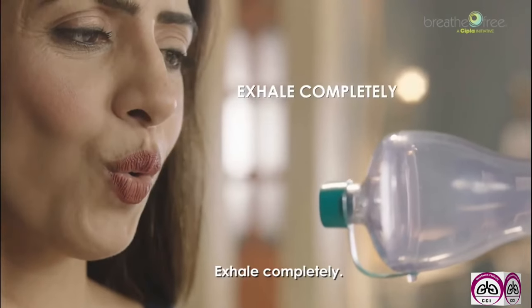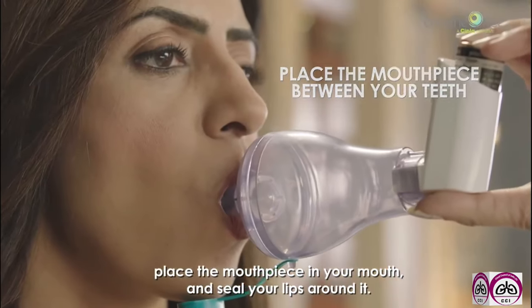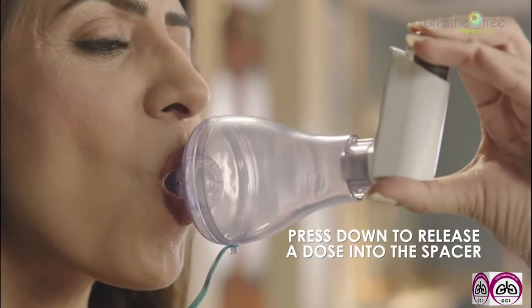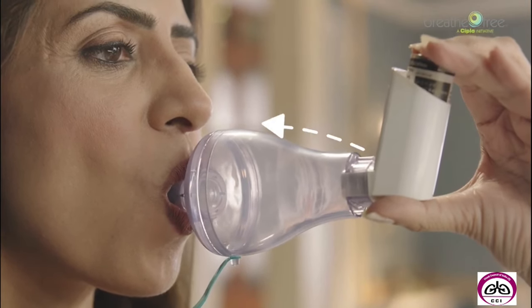Exhale completely. Remove the cap from the spacer, place the mouthpiece in your mouth and seal your lips around it. Press down the inhaler's canister to release a dose of medicine into the spacer. Inhale slowly and deeply.